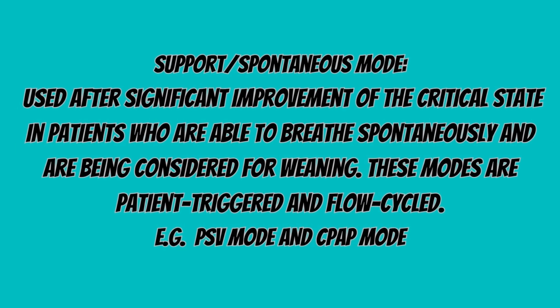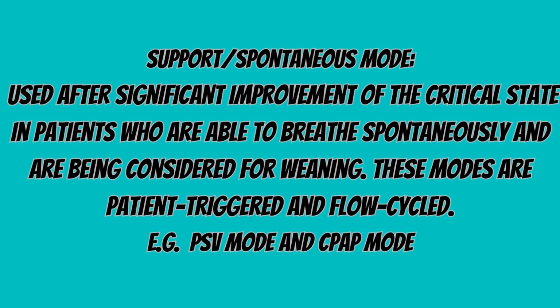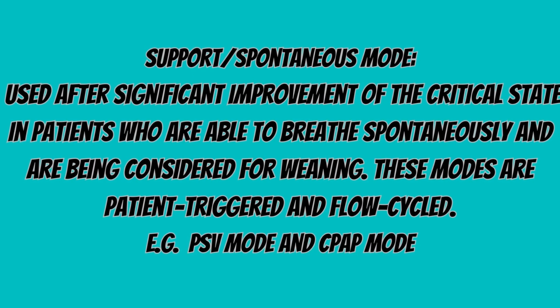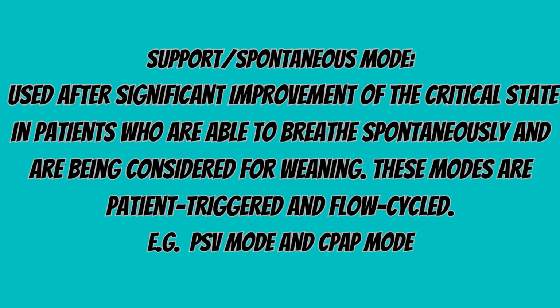Support or spontaneous mode of ventilation. This mode is used after significant improvement of the critical state in patients who are able to breathe spontaneously and are being considered for weaning. These modes are patient-triggered and flow-cycled. For example, pressure support mode and CPAP mode.